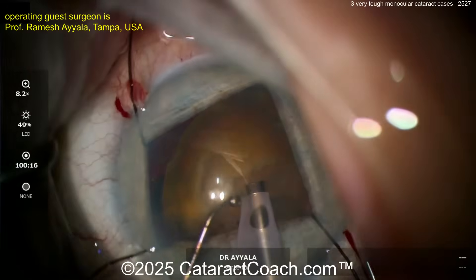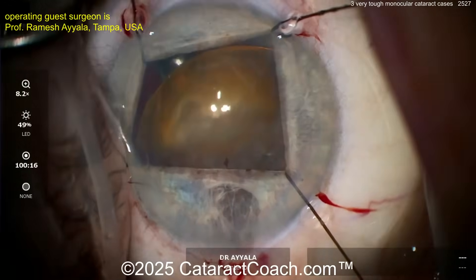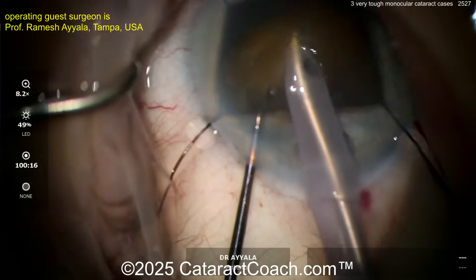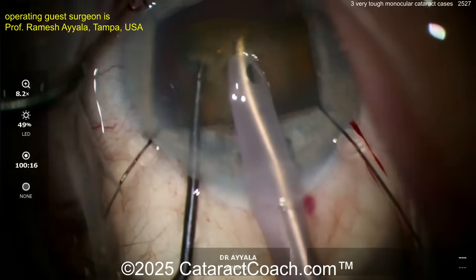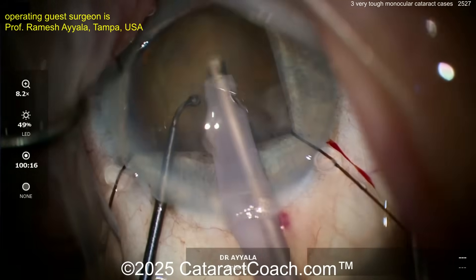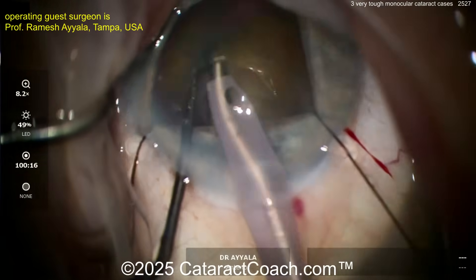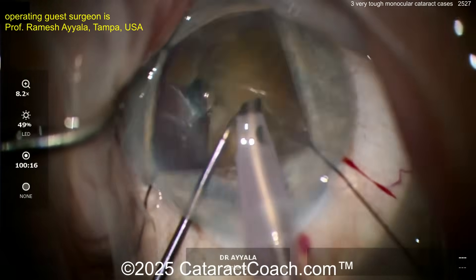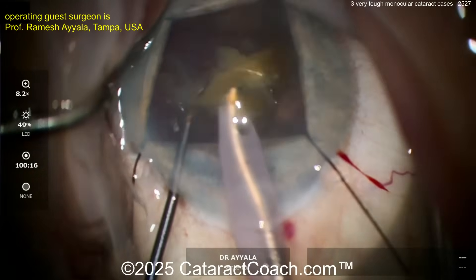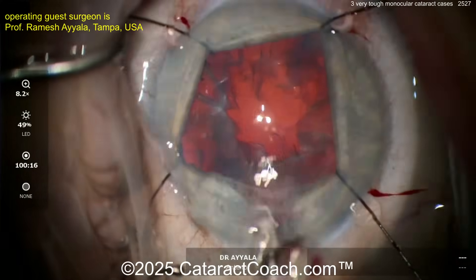Look at the very limited view and access. The nucleus looks like it's semi-tilted up here — it's going to be very difficult. Here comes the phaco probe again. Let's see the chop technique. There's the chopper, and I like this idea of chopping off little pieces at a time. This is so stressful — the view is so challenging, the working space so minimal. These are the most stressful eyes. Myopic eyes I love; it's these tiny hyperopic nanophthalmic eyes that are so stressful.